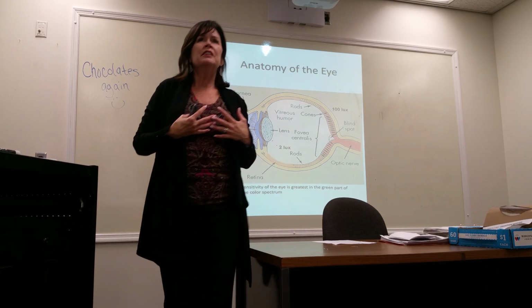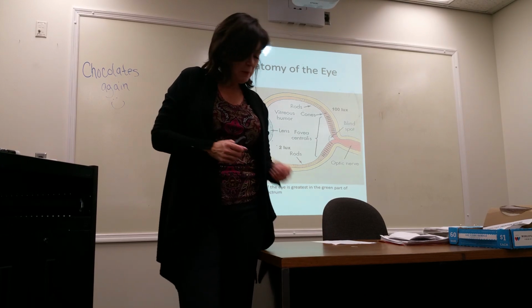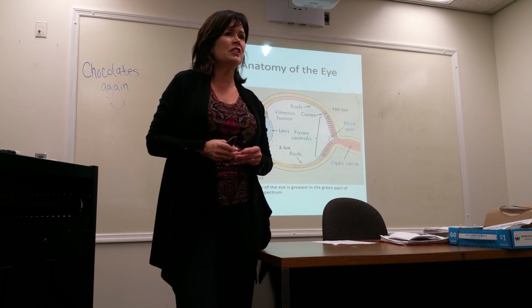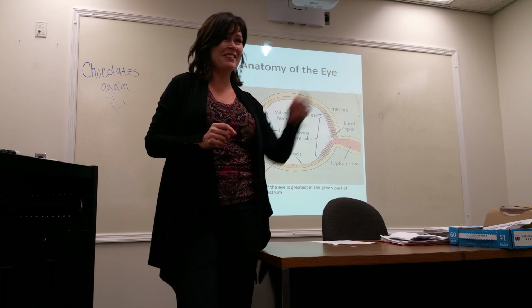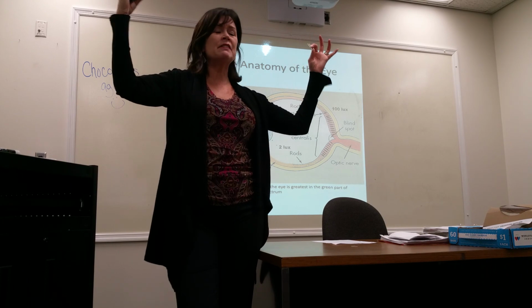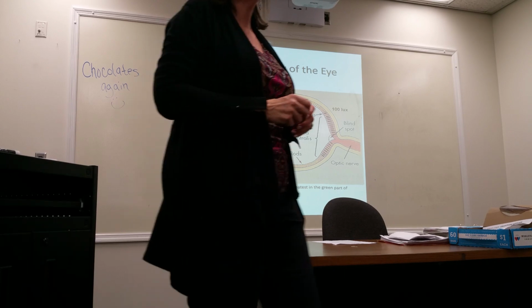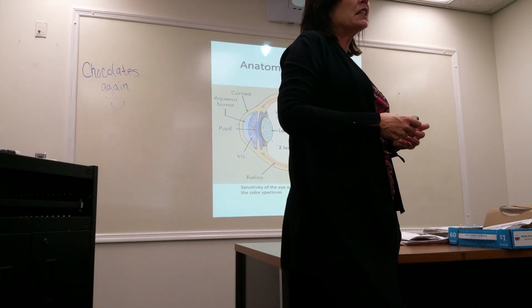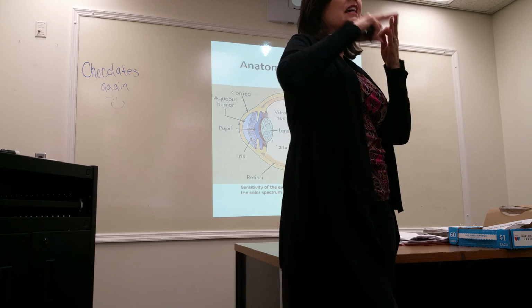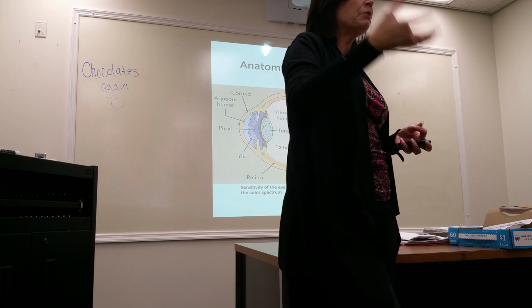Remember what radiologists had to do back in the old days, before my time, before they came into the fluoro room? Yes, they had those red goggles. That was to filter. To go from this light into a dark X-ray room takes time for the eyes to adjust. The minimum amount of time for the eyes to fully adapt to the dark is about 20 minutes, and I think 10 minutes to be able to perform an exam.